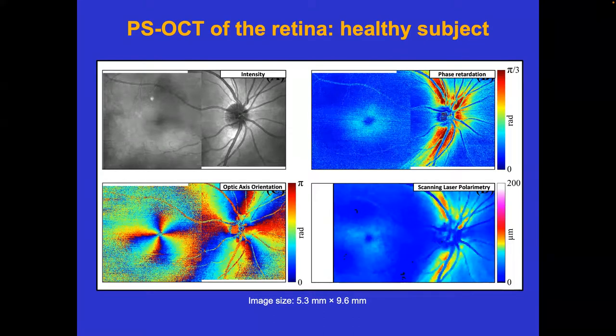This was the area where you have your highest density of photoreceptors. Each photoreceptor needs to have its nerve going to the optic nerve. So out of the point, all these nerves go out like this and then accumulate. They go radially out, and then collect and go. So that is what you see, that radial pattern. If you then look at the optic nerve head here, this is where all these nerves come in from all the different directions. Again we measure that radial pattern. So this is the direction with which these nerve fibers accumulate.